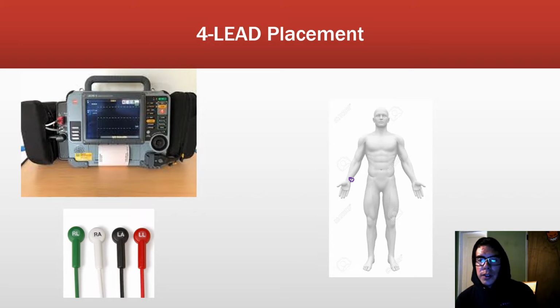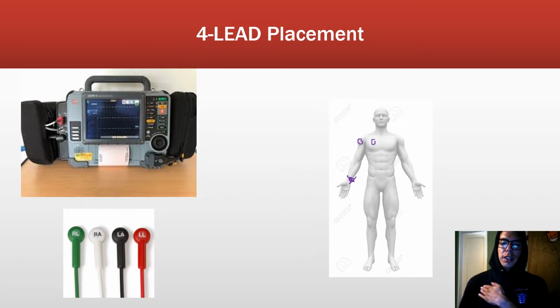So it'll usually go right there on the right wrist, but the next spot you could do is the bicep, or right here on the shoulder, which is fine too, but usually it's either going to be this one right here, or it's going to be up in that area, just below the collarbone, before the shoulder. That's a good spot to put it if you need to put it in towards the torso. But usually, like I said, you want it out on the wrist, in this area.